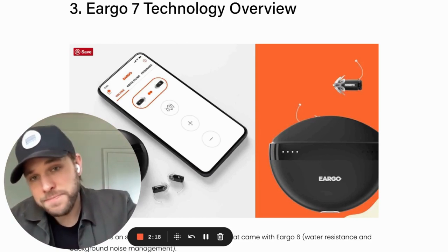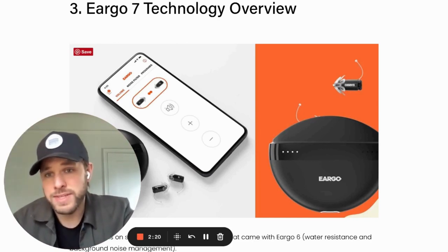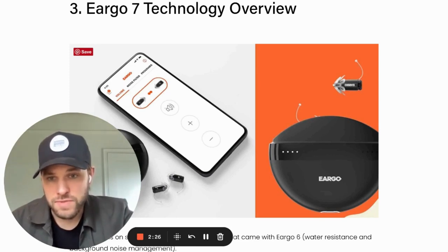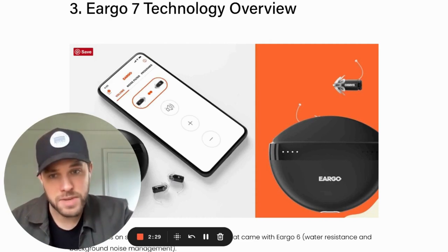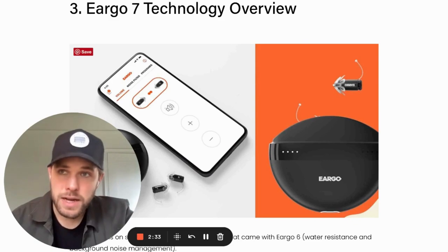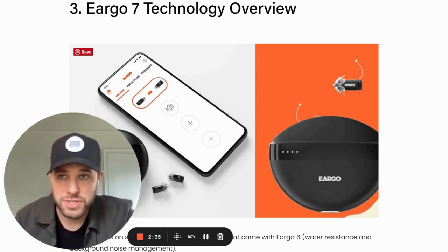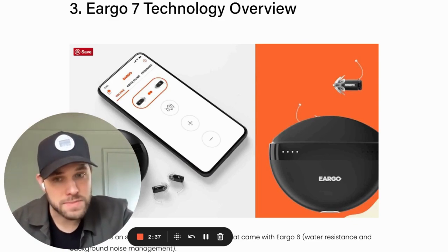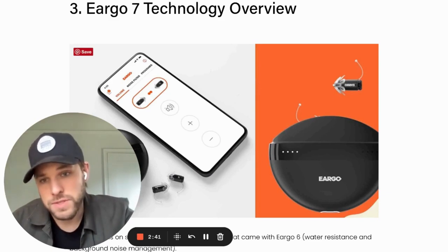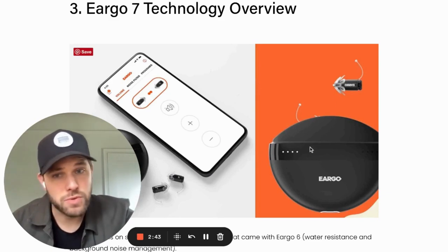Another thing that is unique about Eargo is that it's self-fit. You'll use an app to take a hearing test right through the devices, and the results of that hearing test will be automatically programmed to update your hearing aids. You're not going to work with an audiologist, though if you get stuck, Eargo does have audiologists on staff who can make remote adjustments to your devices. Most people go through the process themselves at home, and that's what I did for this review.